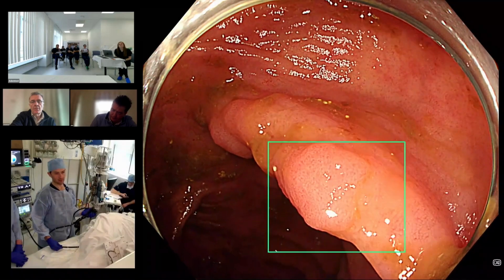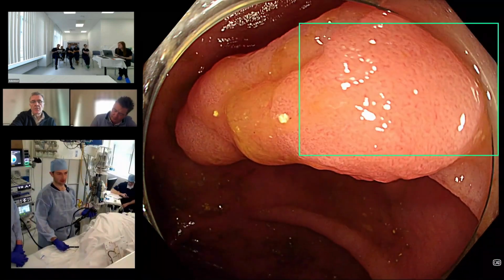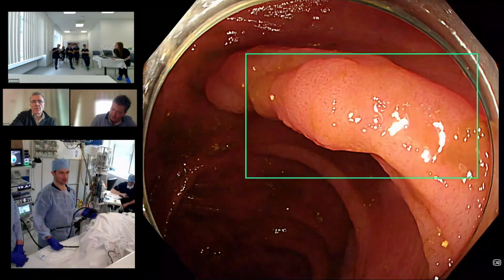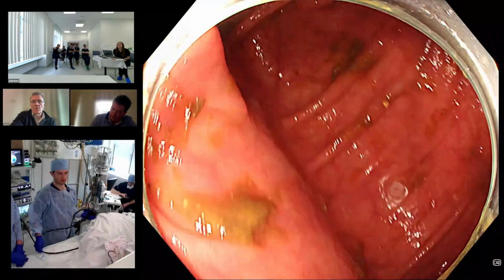So I've had to push the scope in quite a bit to get this angle on it, right? Because you see the sort of looping that's going on here, and this can be the case in the mid-transverse. Okay, so I'm pretty convinced that this is flat, Paris 0-2A, no demarcation zone.